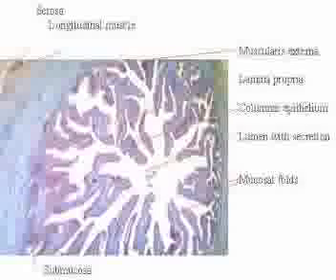The area in the picture is the ampulla. Note its numerous mucosal folds which are not villi because the projections are from the underlying lamina propria. The muscularis externa is staining pink.